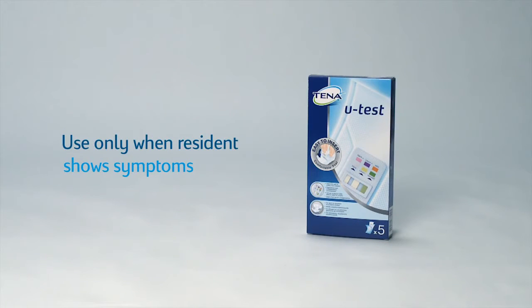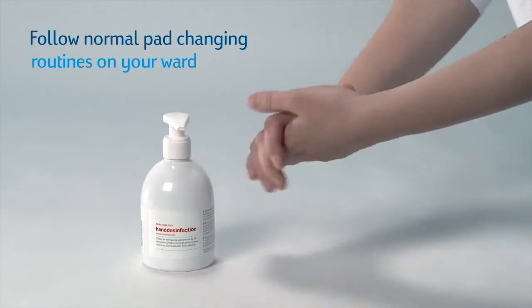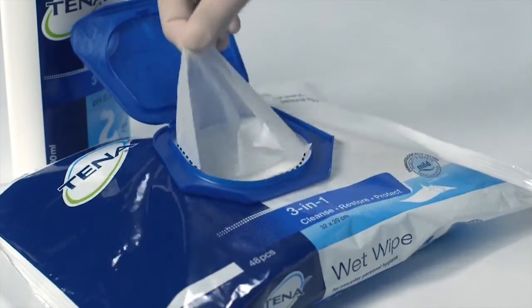Only use the test if the resident shows symptoms. First, clean the resident's genitals and skin that will come into contact with the test. Do not use TNAU test if the skin is injured.